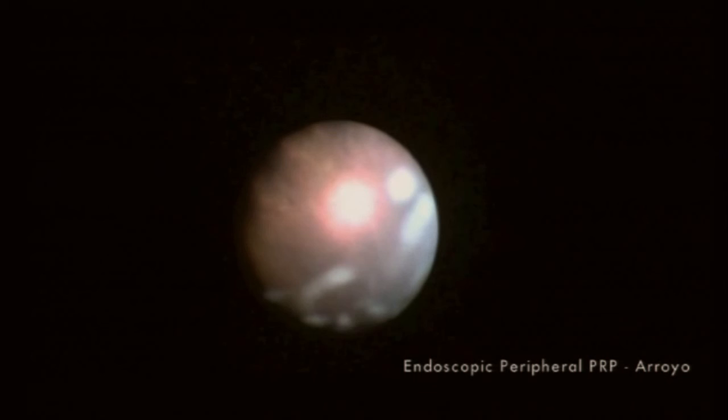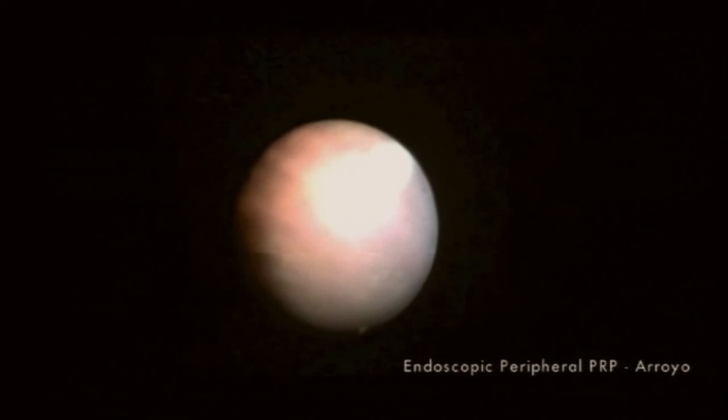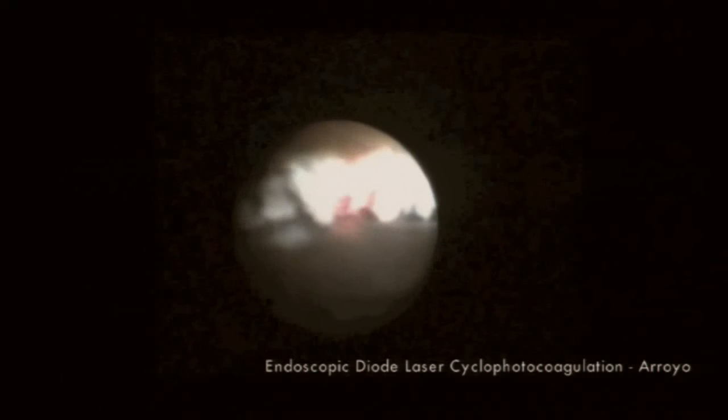These are areas that we don't typically do such a great job at treating. And finally, 12 clock hours of diode laser endoscopic cyclophotocoagulation treatment are applied, also with excellent postoperative control.